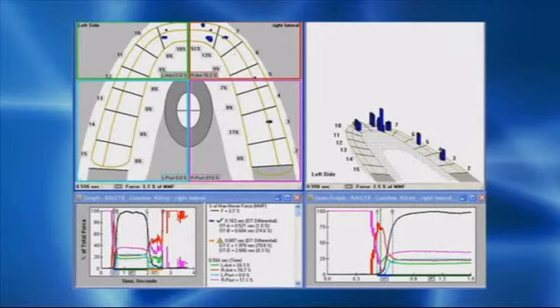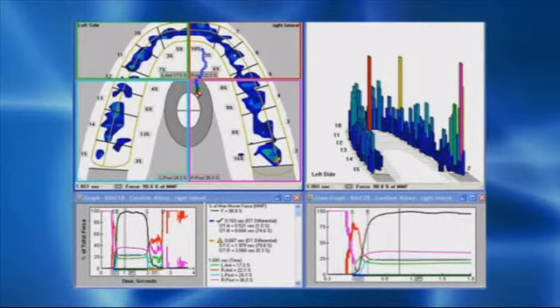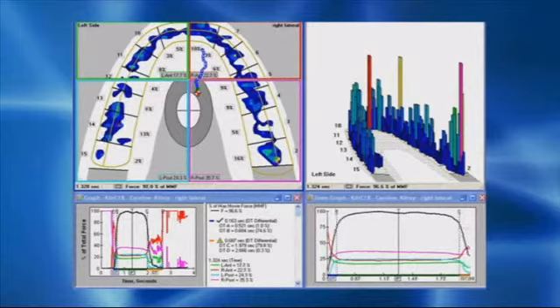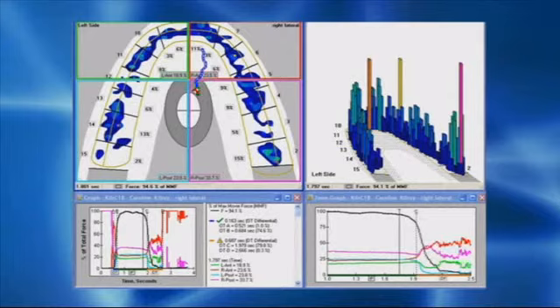So now, Carolyn, when you close, you're much more balanced. You're a little more right-sided than absolutely perfectly balanced, but you're much more centered with your center of force. It doesn't travel way off to one side, which is a significant improvement, and the total center of force is more forward and within the middle of your occlusion.